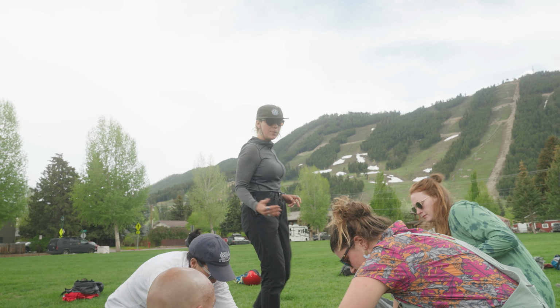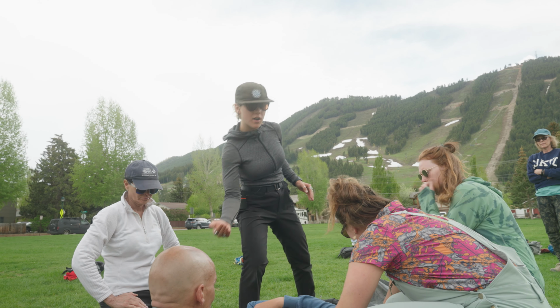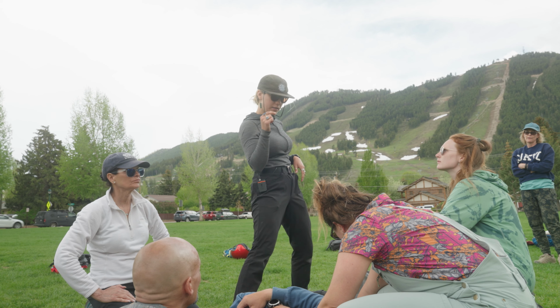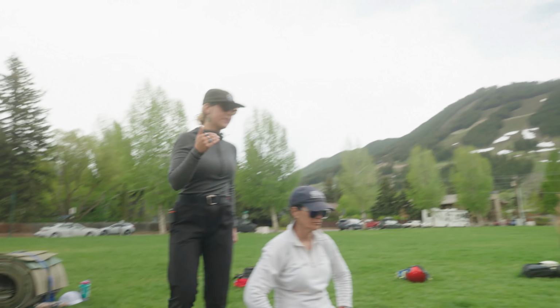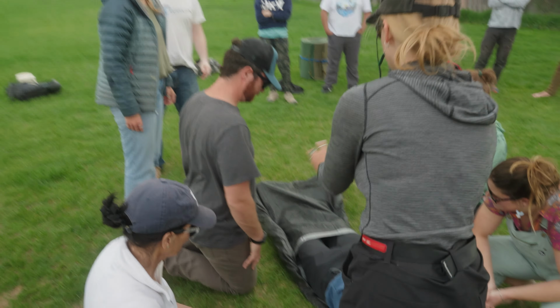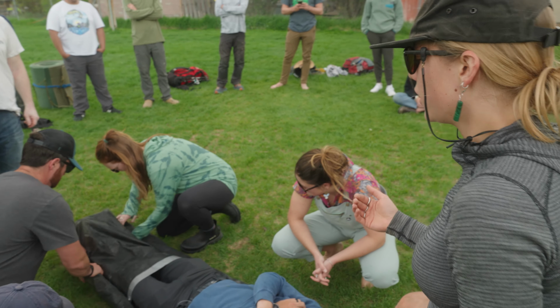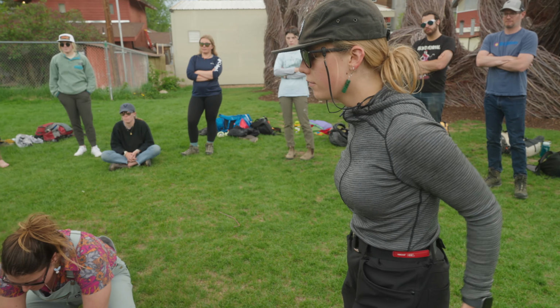Yeah, exactly. This becomes like an improvised backboard. The closer we are into, you know, almost being underneath our patient here, it becomes really rigid. Now I'm going to need 1, 2, 3 more people to come on in on either side. You can have your patient tuck the legs in, just like you can tip his toes towards each other so that you can be rolled in towards your patient. Nice. Okay, so now you guys are going to line in on either side.